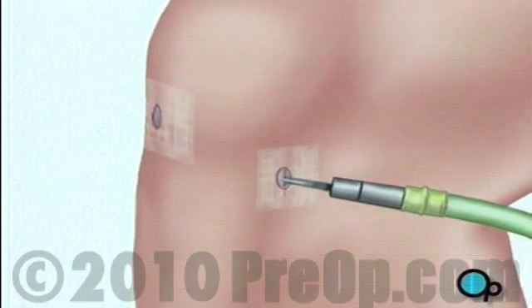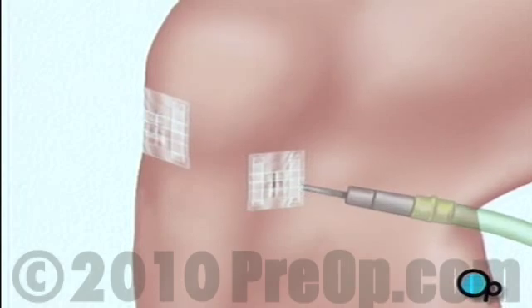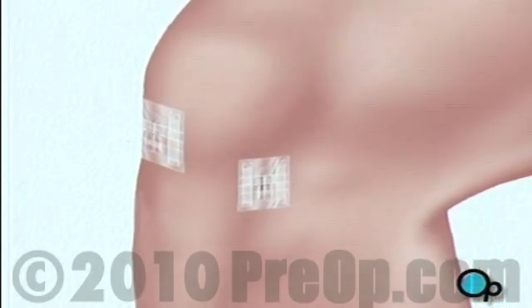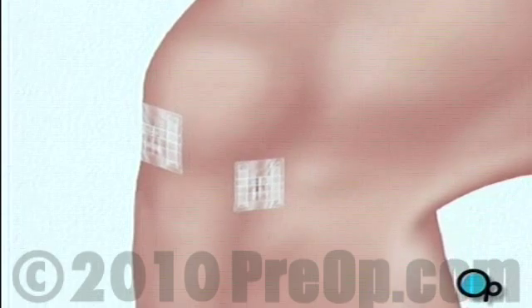Following surgery, sterile dressings are applied. To aid in healing, your knee may be stabilized with a brace, and you'll be encouraged to use crutches during the recovery process.